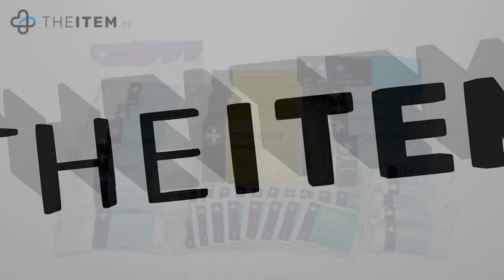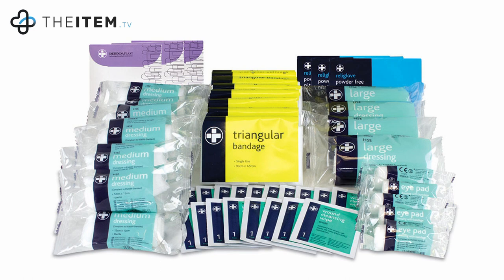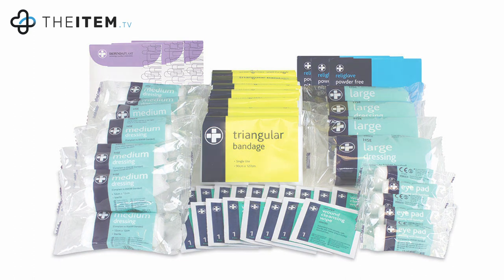Now let's take a look inside the box. We have eight triangular bandages, six eye pad dressings, four large HSE dressings, 12 medium HSE dressings, three pairs of gloves, one guidance leaflet, 60 assorted wash-proof plasters, 16 safety pins and 20 cleansing wipes.